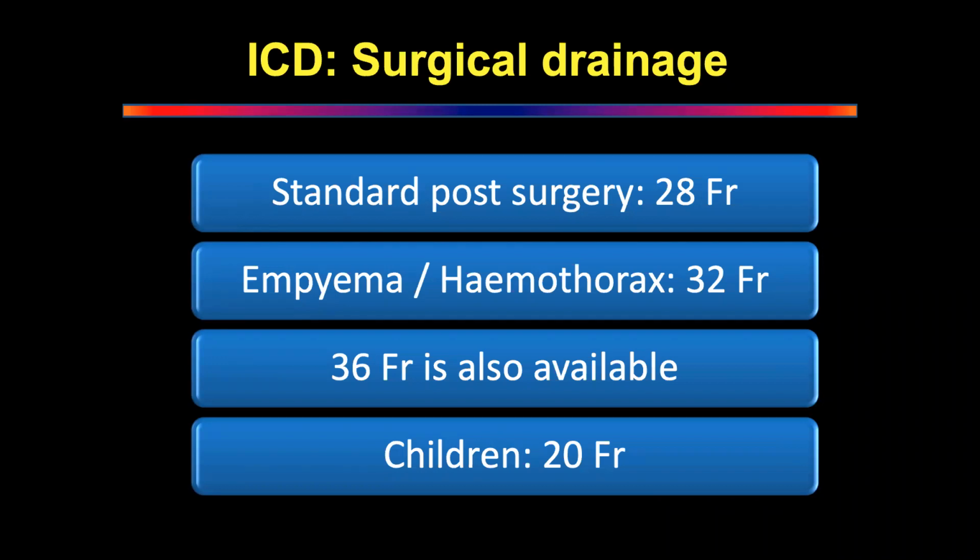Sir, based on the etiology, if it's pneumothorax, I would like to put the drain in the mid clavicular line, second or third intercostal space, the tip directed towards the apex. And if it's a liquid content, that is hemothorax or pleural effusion or empyema, I would like to go through the triangle of safety, which is the fifth intercostal space, or mid-axillary line on the affected side.